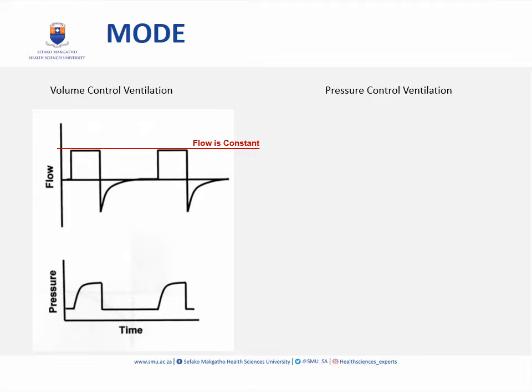So let's think about what is happening in the lung. Initially, as the flow of gas enters the lung is empty, so there's very little resistance to flow, and the pressures are low. But quickly as the lung fills up, the resistance increases, so the pressures go up until you reach the peak pressure at the end of the positive deflection. And then with expiration, suddenly the pressure all goes down as the gas rushes in the other direction. So that's why this curve looks like a shark fin.